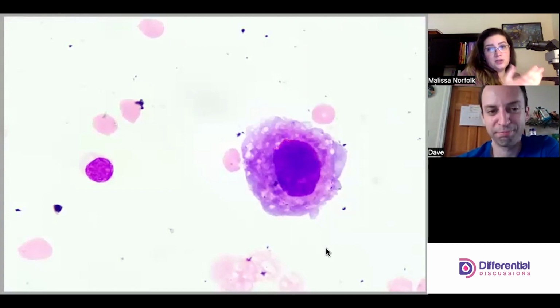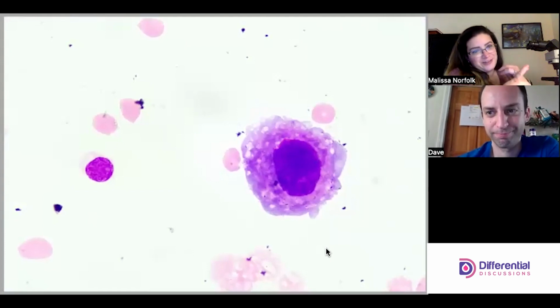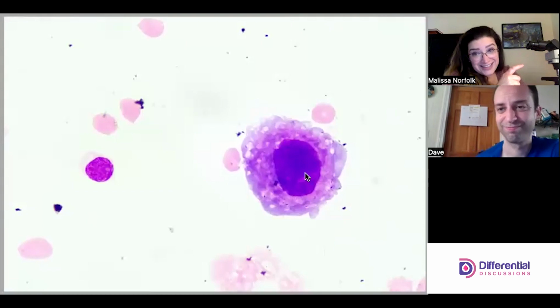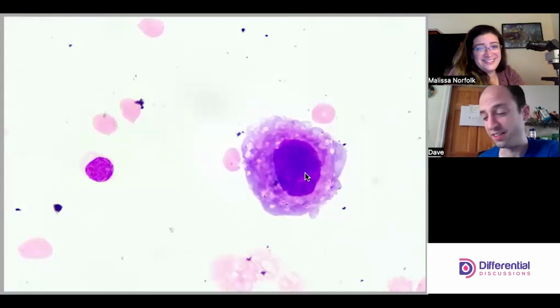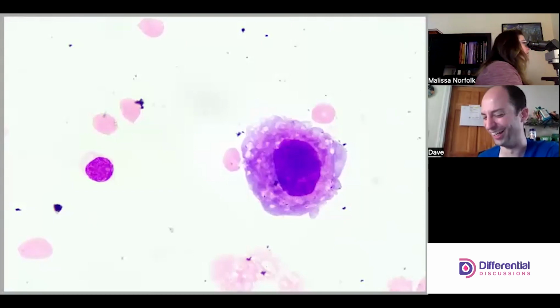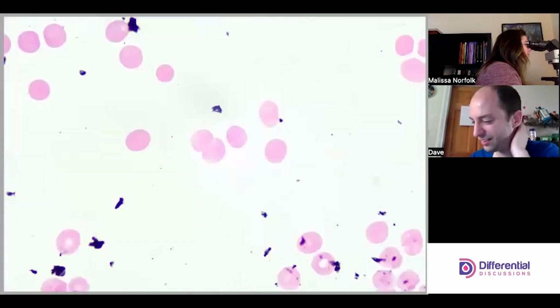When you compare that to this big ugly cell, euchromatin is usually light and fluffy and very nice and easy to see, and this would be heterochromatin. So what is that? What is that indeed? That is a pathology review. Right to the doc. We're just gonna say this large unidentified cell that is wonky looking. Maybe I'll describe it for the doctor and send it back to the path to review.